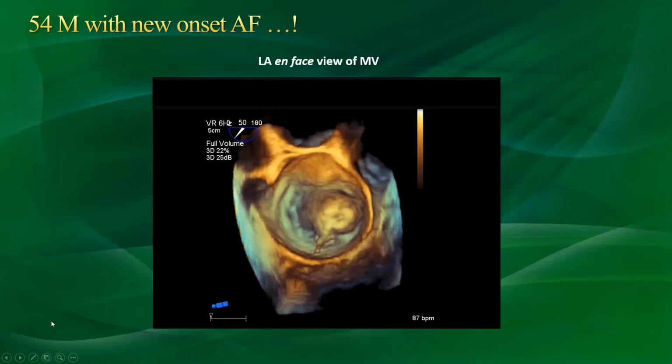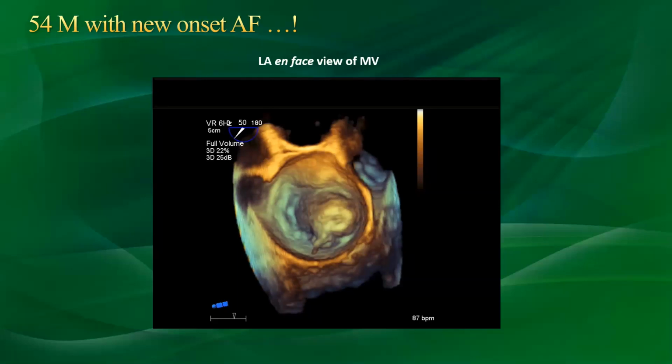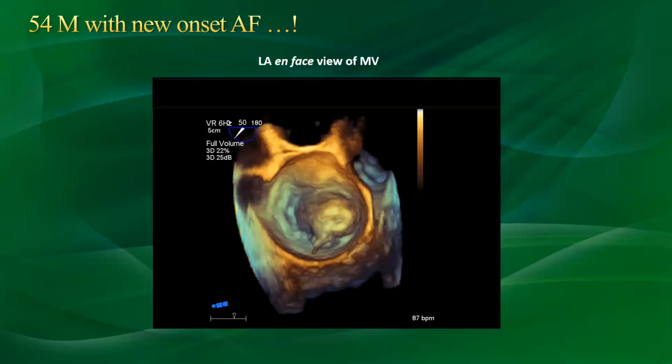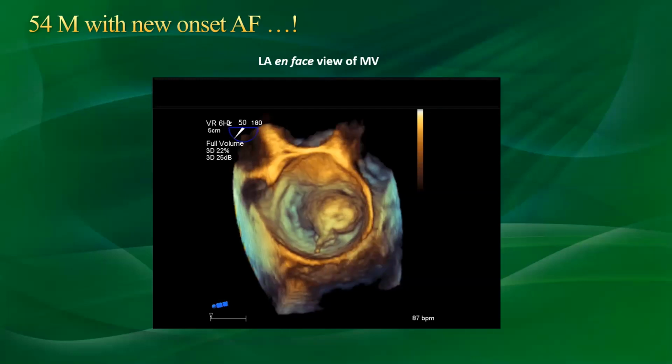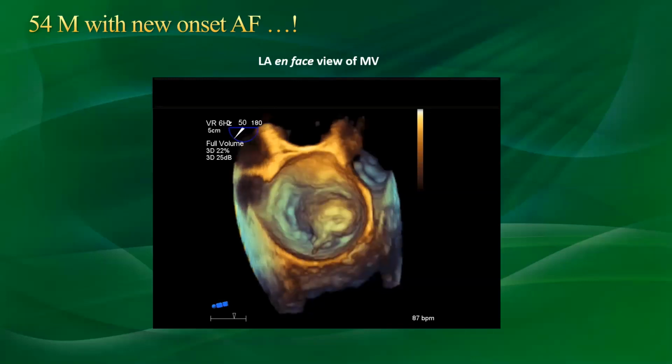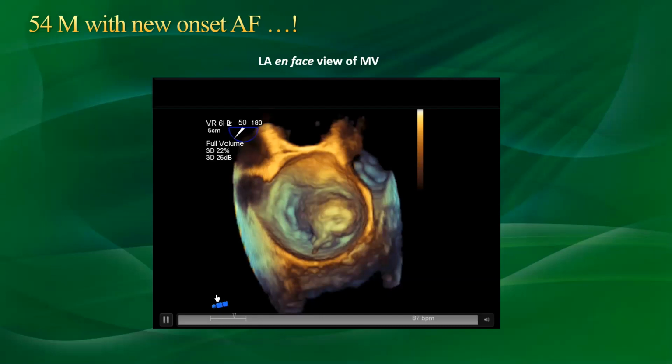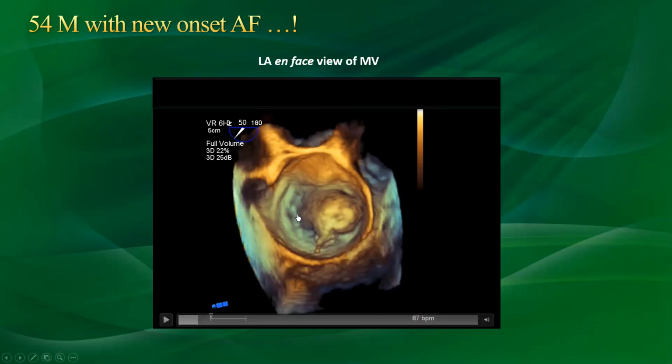So the point I'm trying to make here is we needed 6 clips to look at this patient, and we weren't sure whether this is a posterior leaflet or anterior leaflet. And now with just one clip of the 3D of the mitral valve, our confidence in the diagnosis got much better. We have more information. We can see why some of us think this is a posterior leaflet, right? Because if you look at it with your 4-chamber, 2-chamber, if you cross it here, it falls into the posterior leaflet, but because the anterior is too big, that's what we got there. So there's a reason for that.